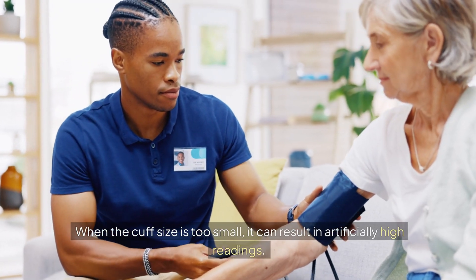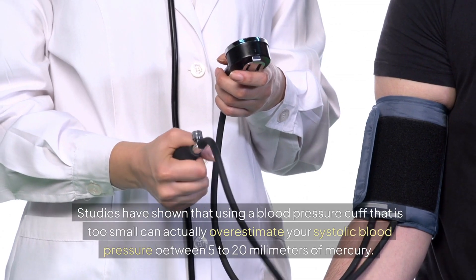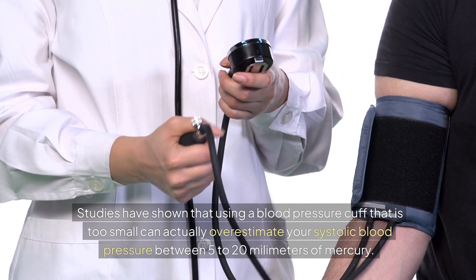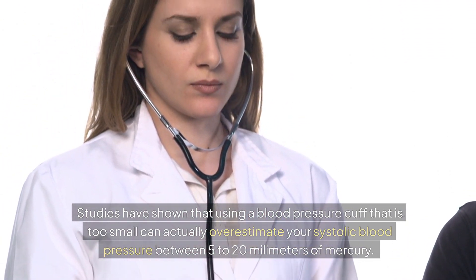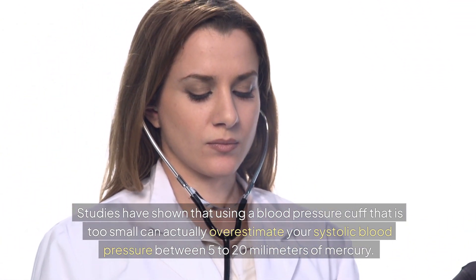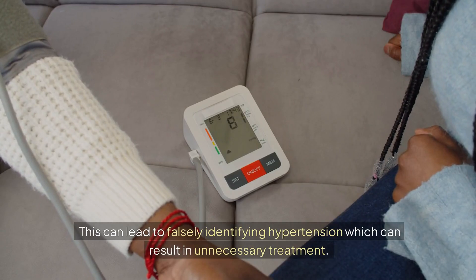When the cuff size is too small, it can result in artificially high readings. Studies have shown that using a blood pressure cuff that is too small can actually overestimate your systolic blood pressure between 5 to 20 millimeters of mercury. This can lead to falsely identifying hypertension, which can result in unnecessary treatment.